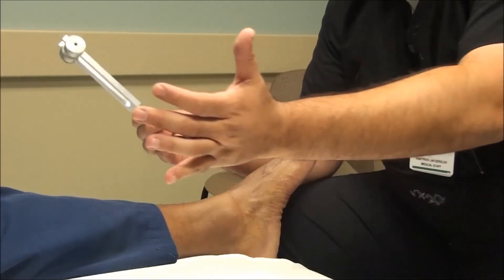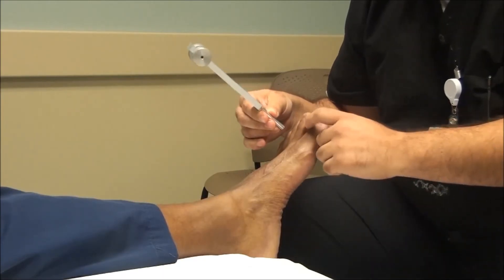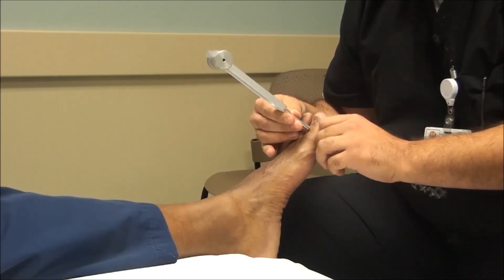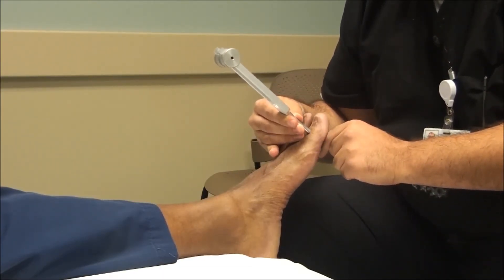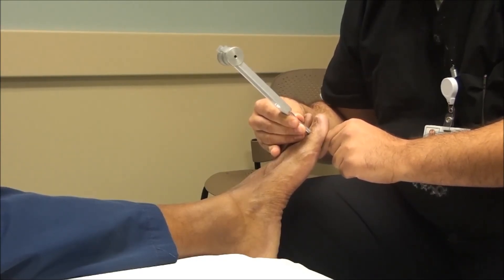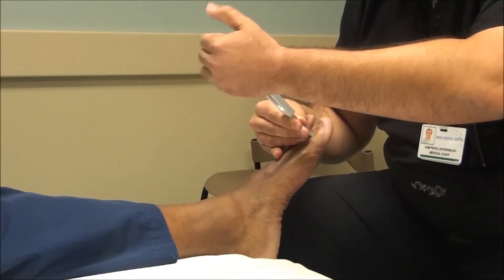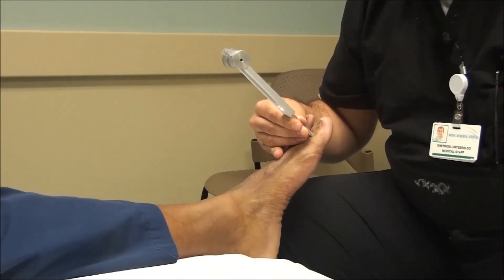What we'll then do is start the tuning fork and place it at a bony prominence in the foot — typically right below the base of the toenails is the most common place we'll start. We'll ask the patient to notice if they're experiencing any vibration, and then stop the tuning fork by suppressing the vibration and ask the patient to identify if they've noticed the vibration stopped.